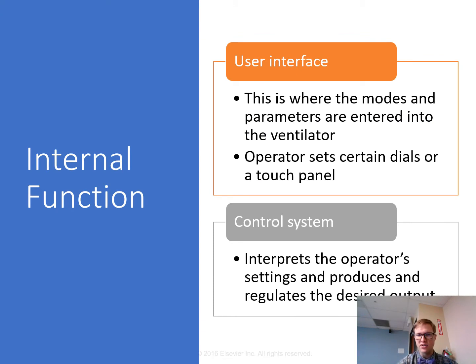All right, so internal function of the ventilator. So we have the user interface. A ventilator can be easily understood if it's pictured as a box that's just plugged into an electrical outlet or even a high pressure gas source, and the gas comes out the other side.